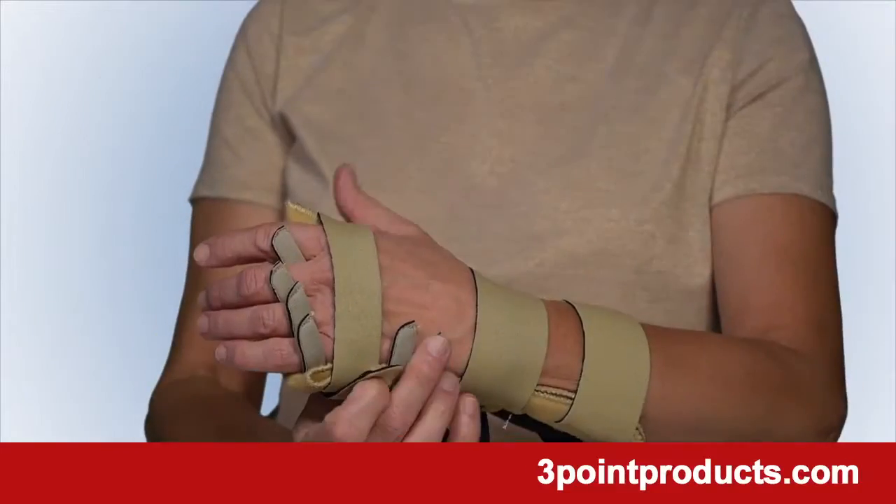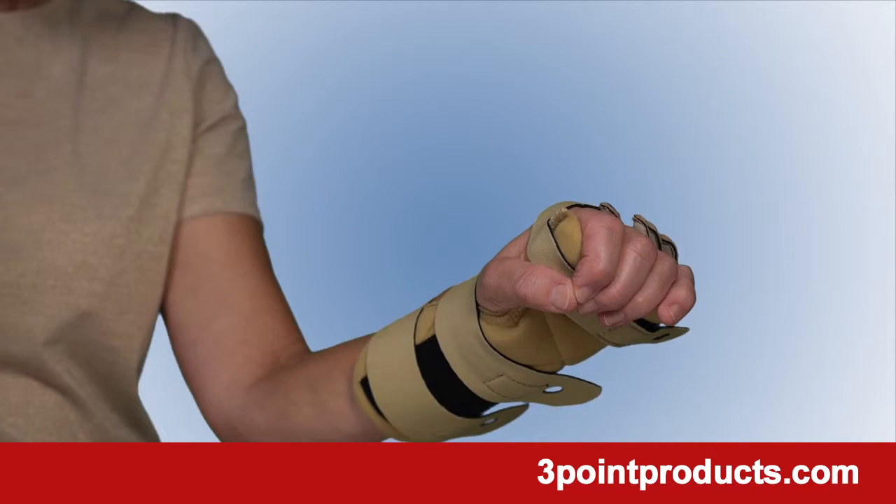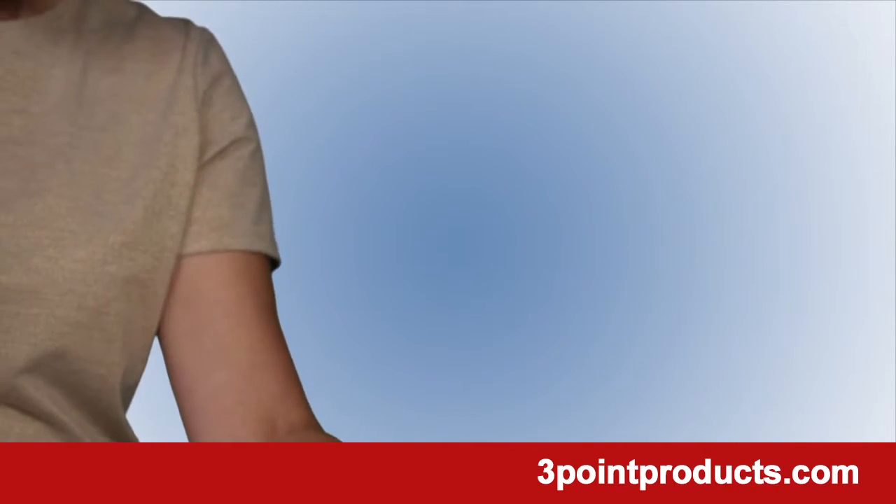The splint supports your wrist and large knuckles but leaves your fingertips and thumb free to let you pull up your covers or adjust your PJs.